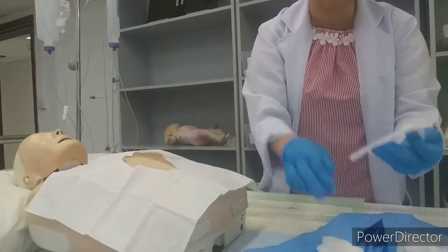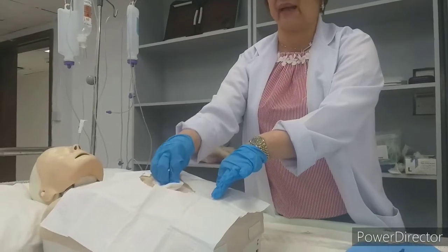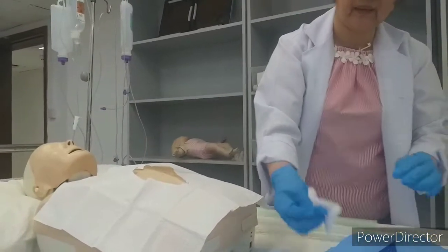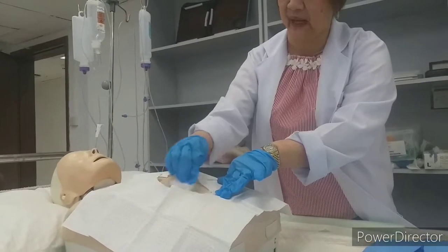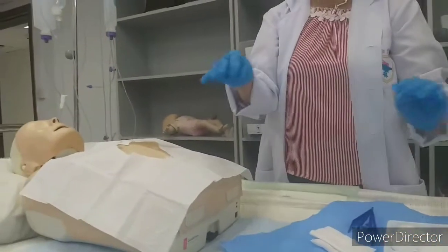We'll get a gauze, fold it into 4, pat, tap, tap, tap, receptacle, again fold, tap in the middle, tap to the whole area, out, receptacle.